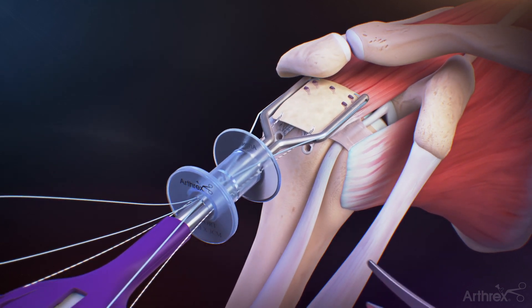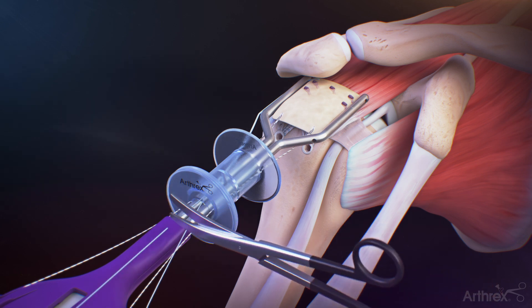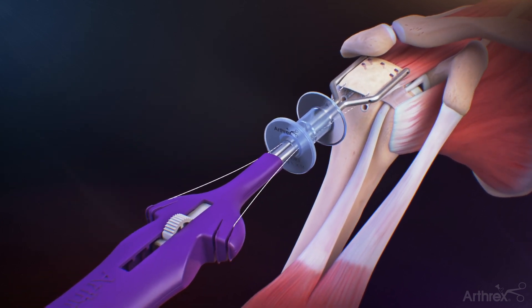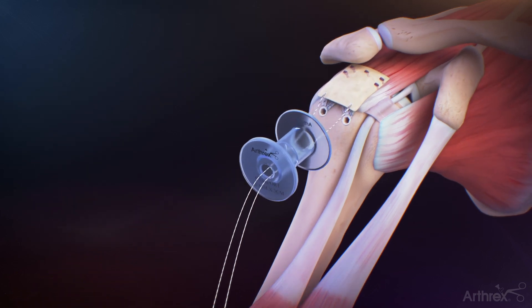Uncleat and cut one end of the medial graft retention sutures before pulling on the opposite limbs for removal. This step must be performed with the graft spreader in place to provide counterpressure during medial suture removal. Uncleat the remaining two sutures from the graft spreader handle, then retract the arm of the graft spreader and carefully remove it from the lateral portal.